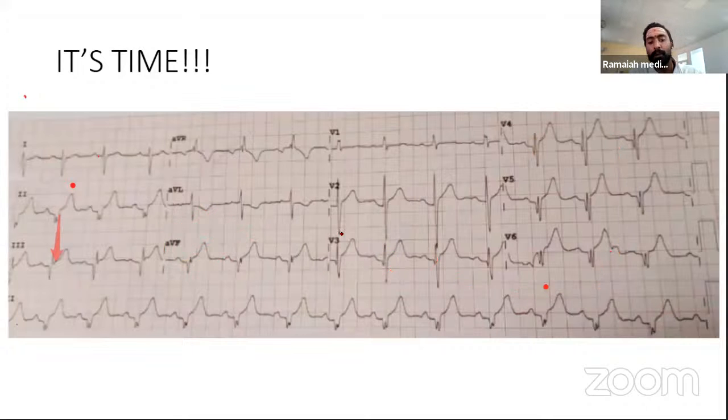Seeing this bundle branch block, you will come to it. Whenever we have something like a right bundle branch, you can sometimes have an extreme axis with a scar. There is some amount of ST segment elevation. There is a definition for ST segment elevation, how much it should be elevated, that maybe we'll discuss in the coronary artery disease part.